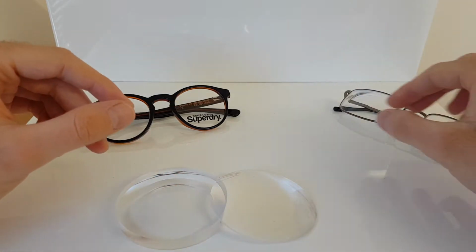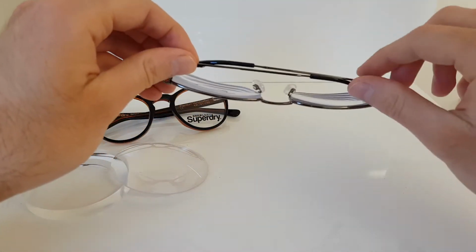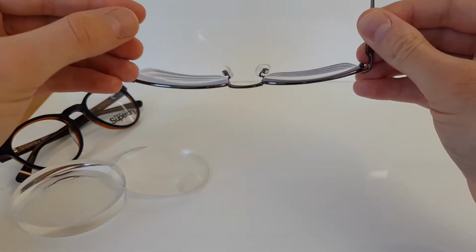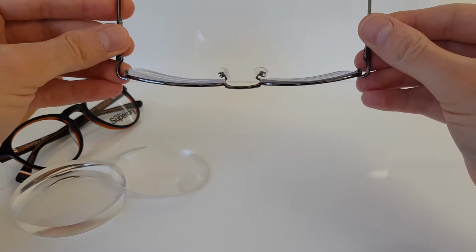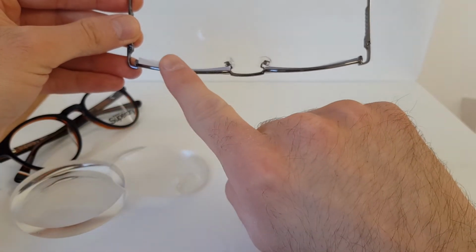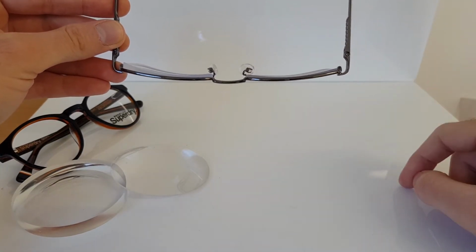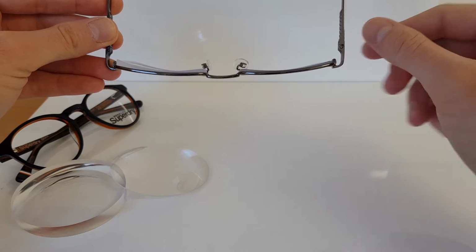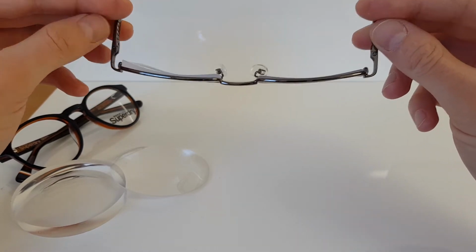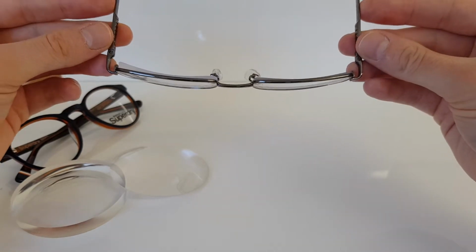Number one is by using a different lens material. So this is an example of that. This frame here has the same prescription lens in both sides. This is a -4 prescription here, and so is this on this side, but we've used a different material. We've used a 1.74 high index lens on here, and there are other indexes available, so don't worry too much about remembering the numbers or anything like that. But that's just to show you what we can do.